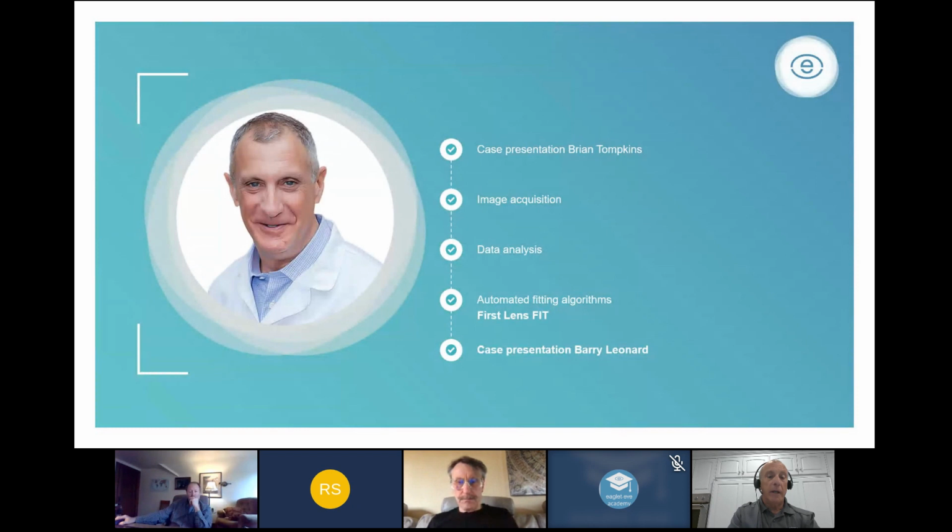You're always going to look at the lens under the microscope. We hope we can see the final sagittal depth with our microscope. It's always nice to double check. The OCT for me has fine-tuned and calibrated my eye under the microscope for looking at that and also at edges. But it's not a necessary thing. Thank you.